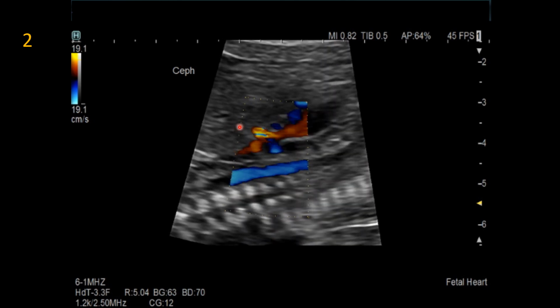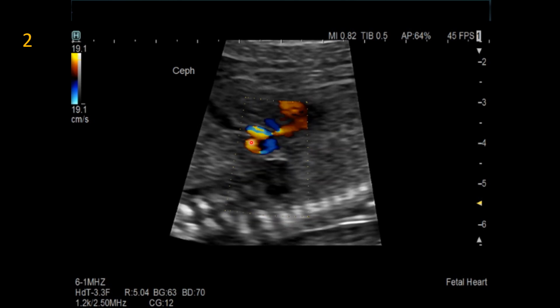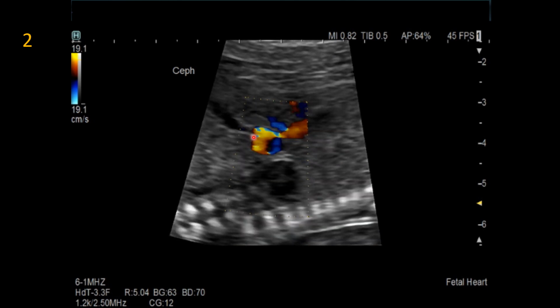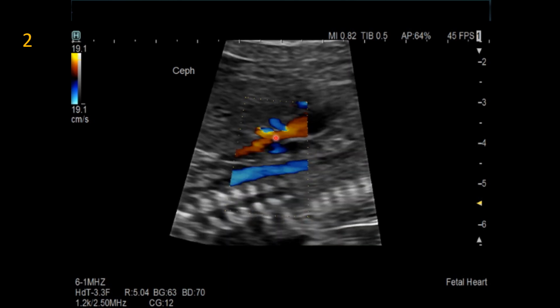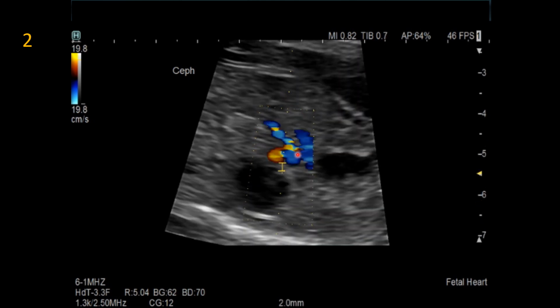The portal sinus is here, this is the ductus venosus, and this will become obstructed. This vertical vein drains directly to where the ductus venosus drains, which then drains to the IVC, and that's how the pulmonary venous blood gets back to the common atrium. Closer look at that.